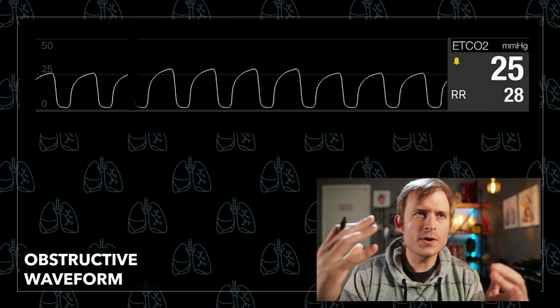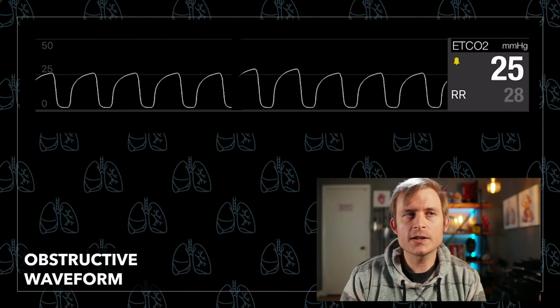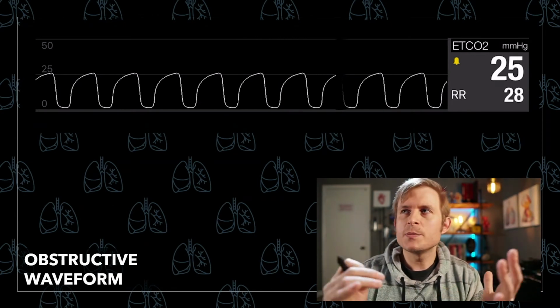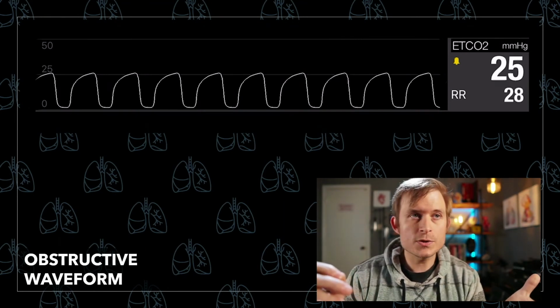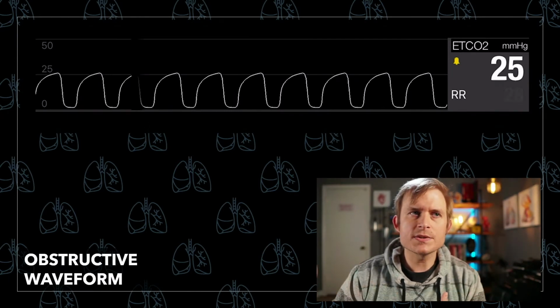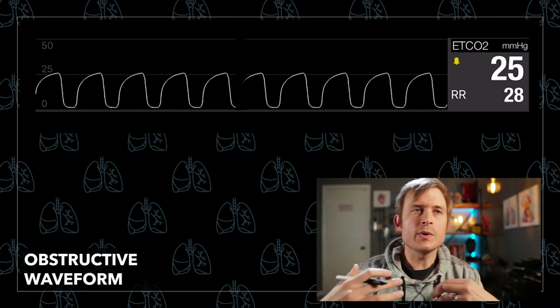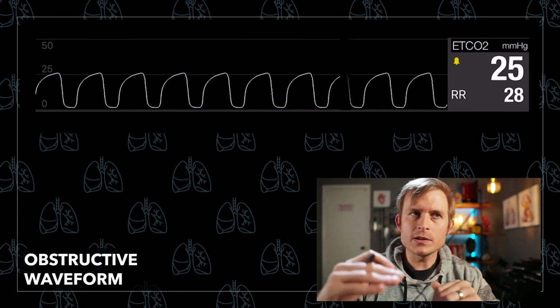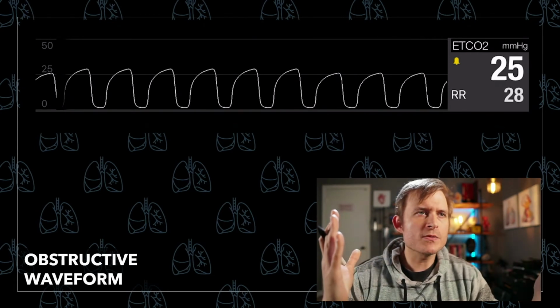And we can couple that with other good clues like lung sounds, which would tell me that this patient is having an asthma attack. So it's very useful. Now, in some asthmatics, depending on the severity of the illness, you may see very, very high levels of end-tidal CO2, at least initially. But as the asthma progresses, the patient becomes more and more panicked and begins to breathe faster. And as a result, we blow off more CO2, so the levels of end-tidal CO2 tend to be slightly lower. Now, here's an example of the mild to moderate type of asthmatic.